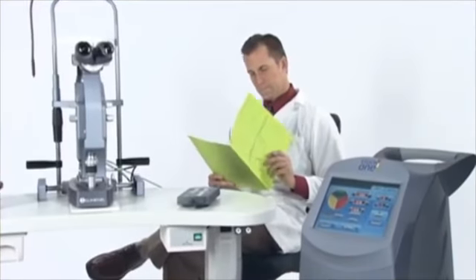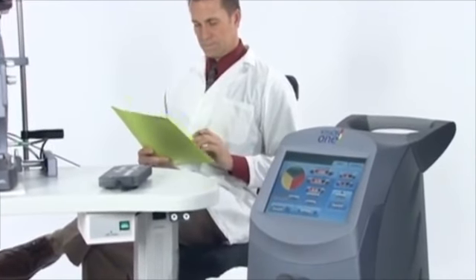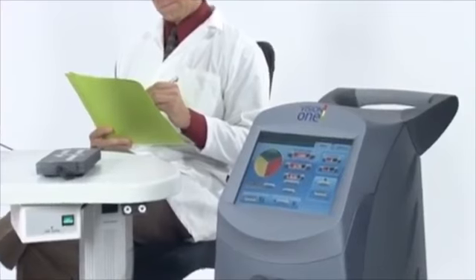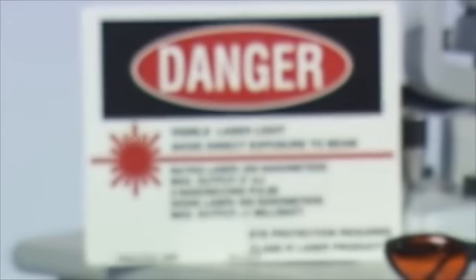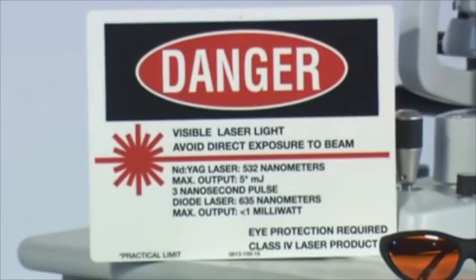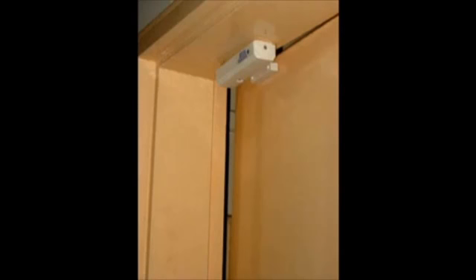In addition to providing the required laser safety eyewear, take the following steps to make sure that the treatment room or controlled area is secure. First, place a warning sign on the outside of the treatment room door when the laser is in use. Next, close and secure the treatment room door during laser operation. Finally, external door interlocks that automatically disable the laser when the treatment room door is opened may be installed.